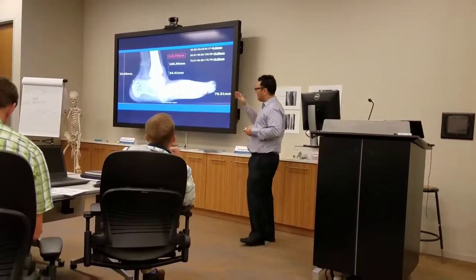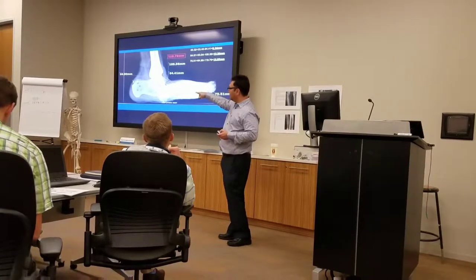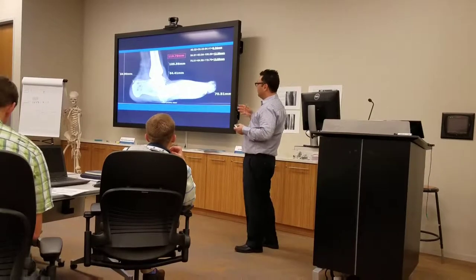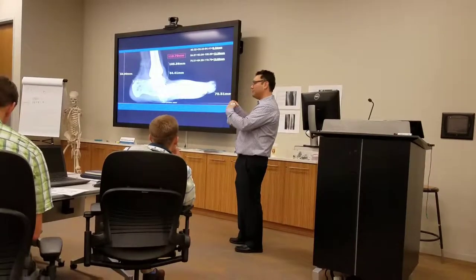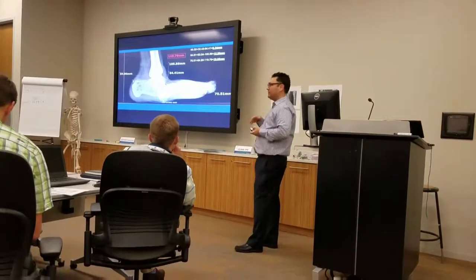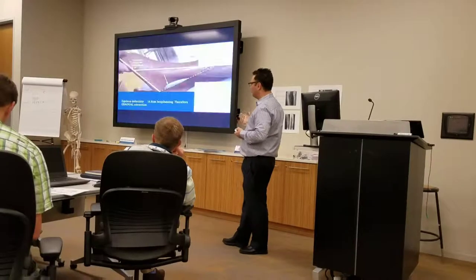And that's just in one plane. And then if you have to add in the second plane of deformity that's getting corrected as well, if there's any rotation, and those are things with the skin that's also been compacted for quite a while, that can end up adding up to a lot of stretch, thereby causing the patient damage that can have poor results.